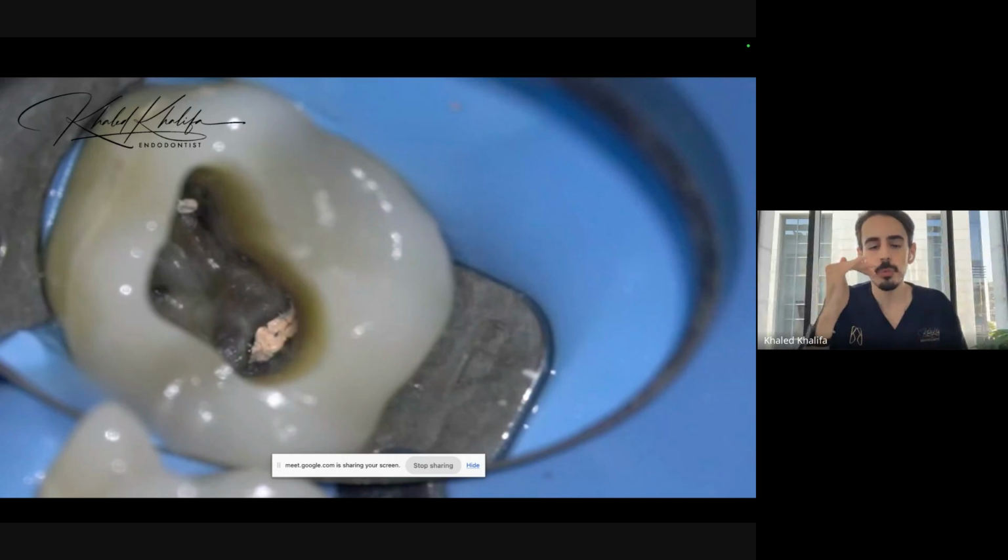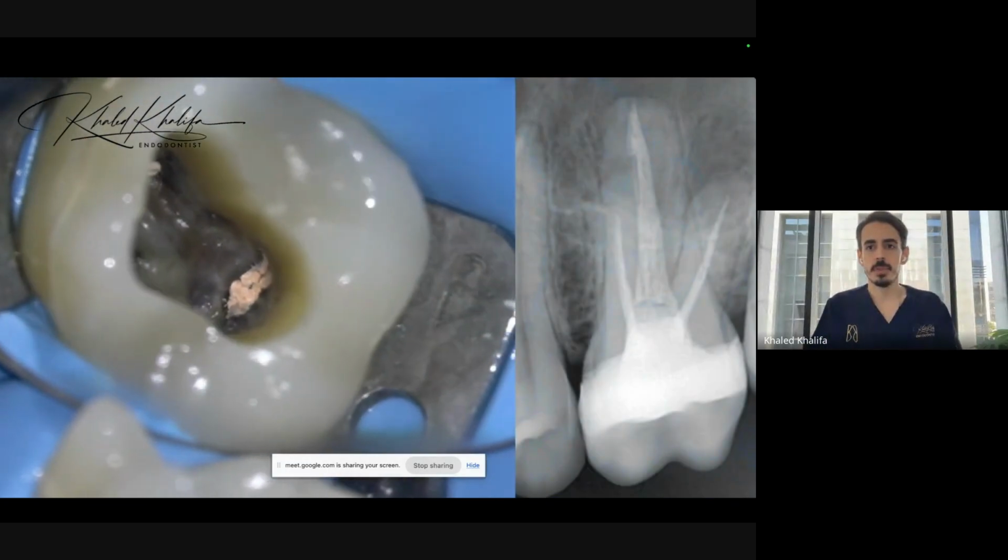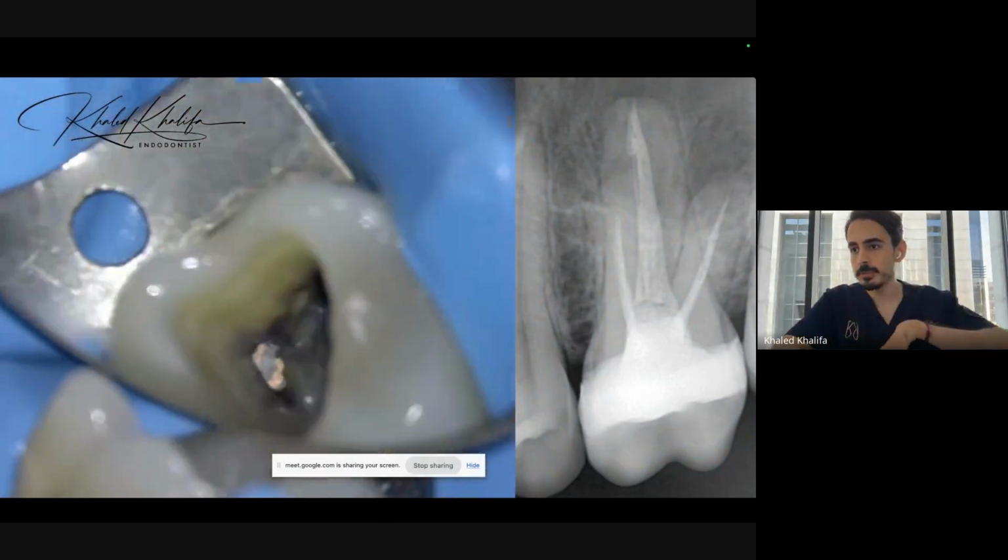But I would go for bioceramic sealer in retreatment cases in literally all the cases to make sure I can reach the maximum success rate. Okay? Let's see this video. This is a retreatment case. Okay?